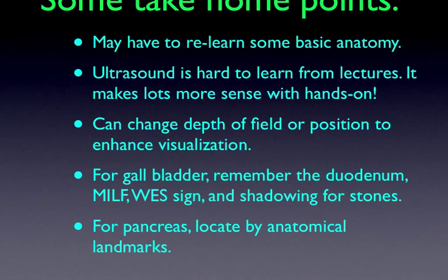So let's conclude with some take-home points. We may have to relearn some basic anatomy, especially when it comes to locating the pancreas. The ultrasound is, I think, somewhat hard to learn from lectures. I enjoy giving the lectures, but it's so much easier once you get a few good views with the hands-on session. So I want to leave a lot of time for everybody to have practice with the hands-on sessions. We can change the depth of field or the position to enhance visualization.